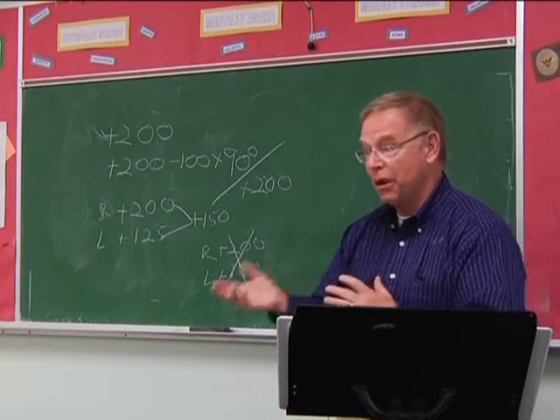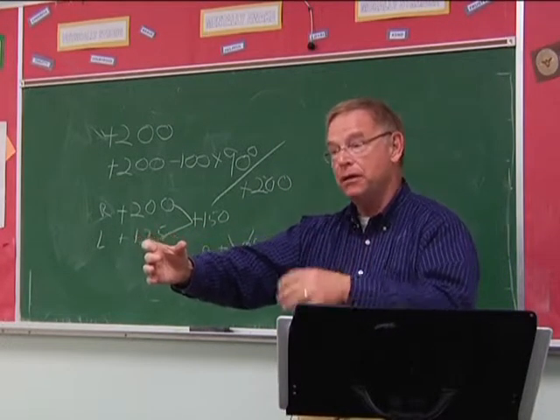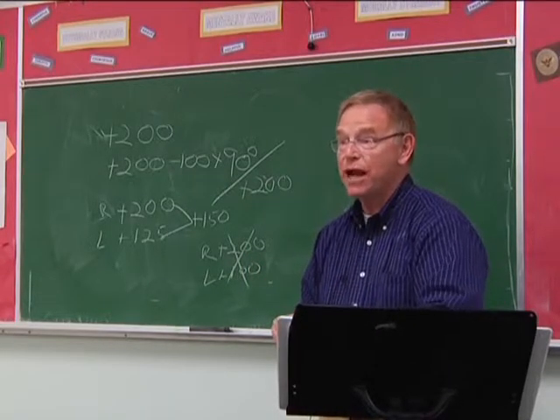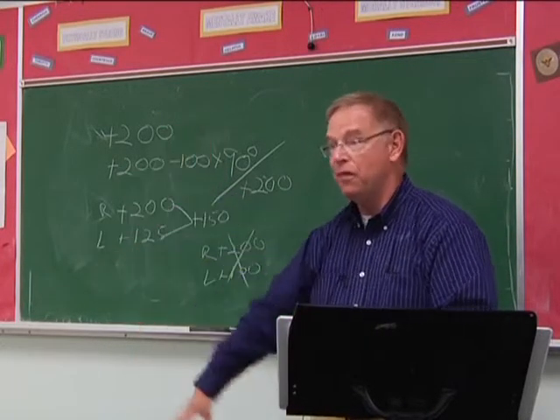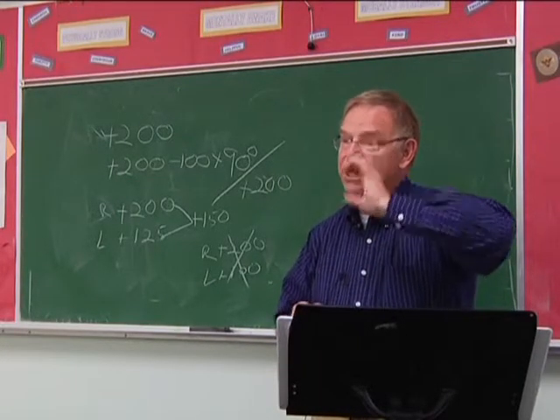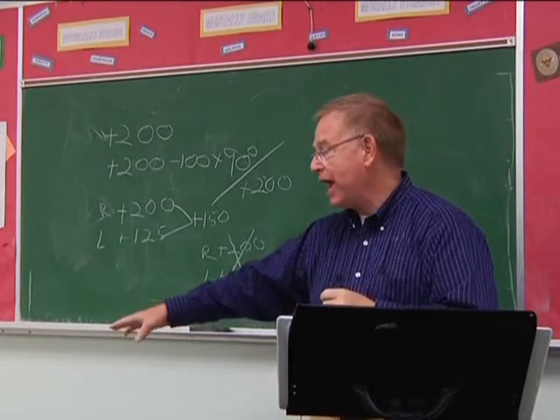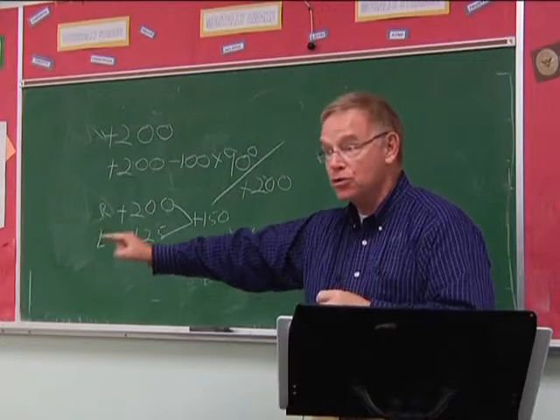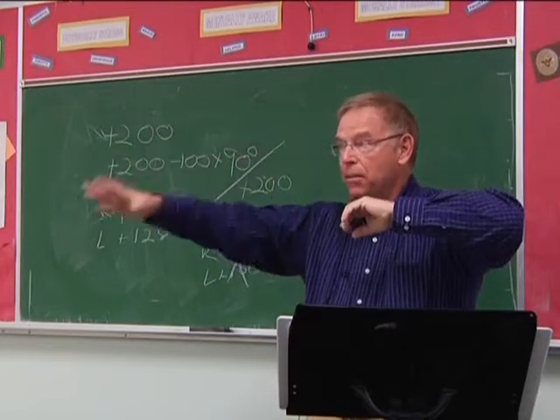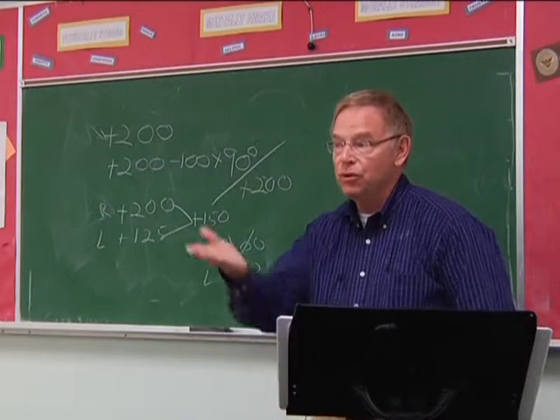Much better is an instrument that I'm using. It's called an auto lensometer, where you stick the glasses in there and hit a button and the prescription pops up on the screen. So that's what I use to go through thousands of pairs of glasses. So the shake test is really not accurate enough. If you have glasses that are spheres or almost spheres, then you can use the shake test to determine what it is. But to take a pair of glasses and try to use the shake test to neutralize it would be a challenge. Wouldn't you agree?